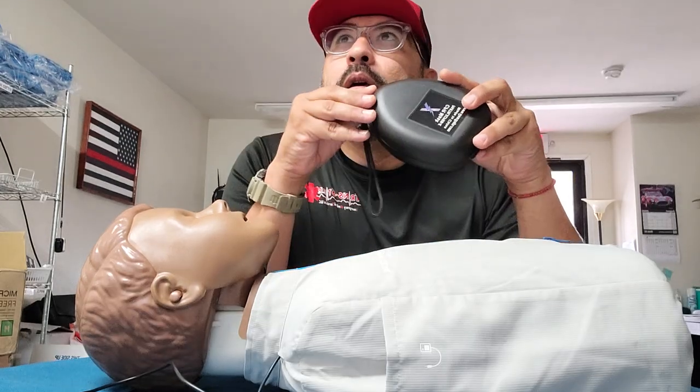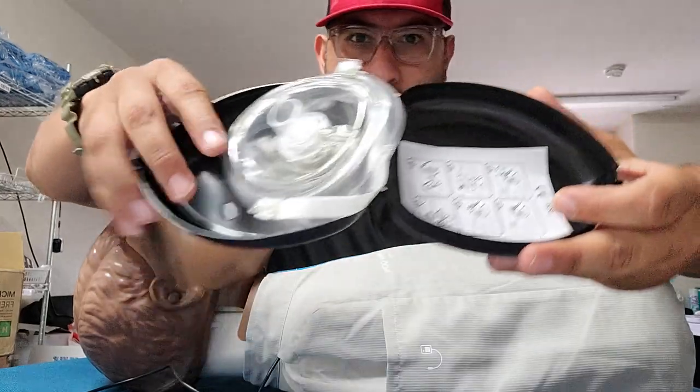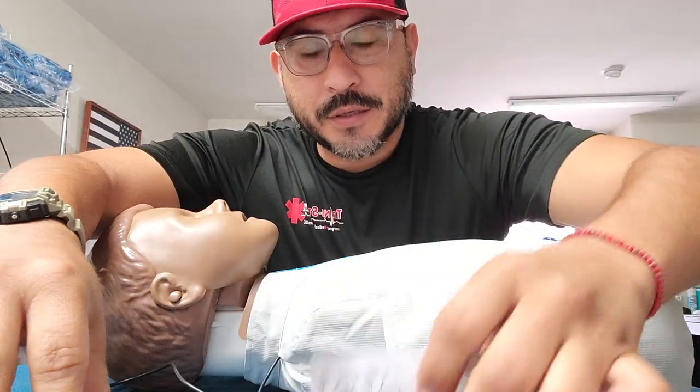It's a mask with a one-way valve. Opening that bad boy up — I'm pretty sure it comes with a CPR mask for dummies.